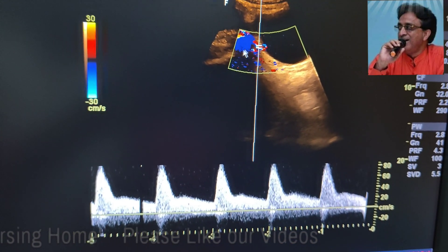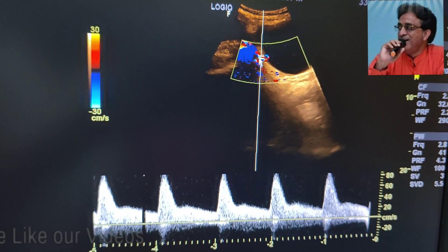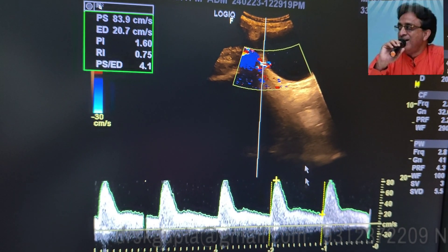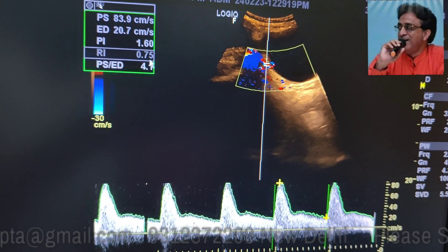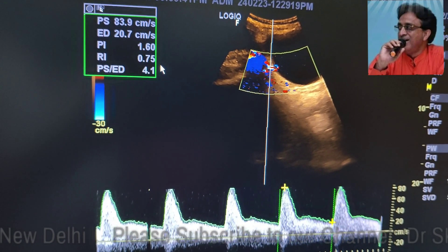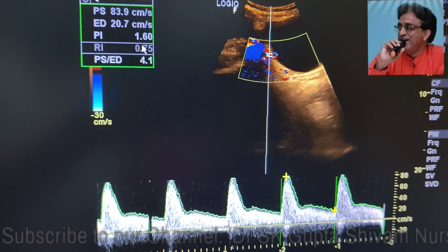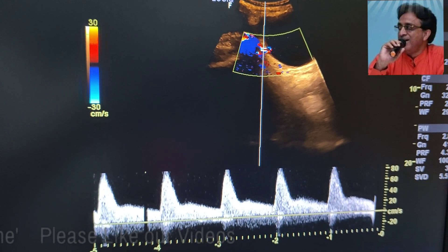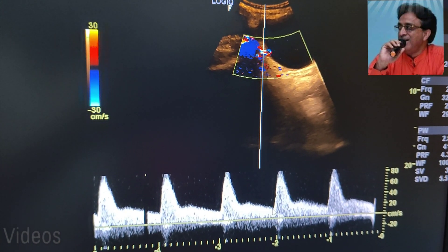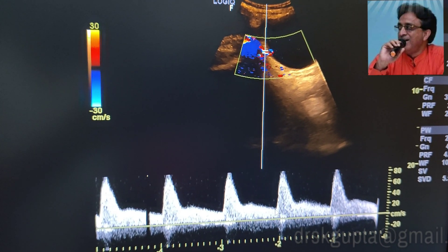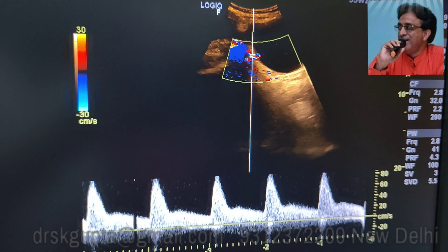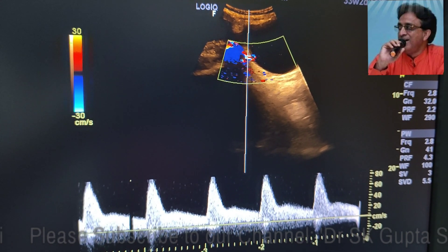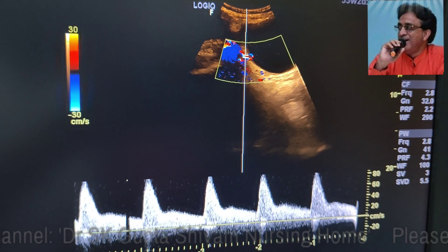When we perform the vascular Doppler of the right uterine artery, we find that it is also showing a resistive flow pattern. The resistive index of the right uterine artery is 0.75 — usually it has to be less than 0.5 — and the PI is also increased at 1.60. There is a diastolic notch in the right uterine flow as well. This means the patient is having a vascular compromise; the vascular flow to the placenta and fetus is compromised, giving rise to IUGR. This patient might be having pregnancy-induced hypertension or other causes which need to be investigated.